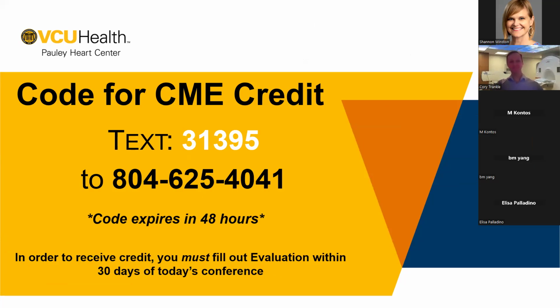I did want to make one comment about the heart rate or the time limit for obtaining images. 60 seconds is a very good guideline, but as we've all seen, or those who do stress echoes or any type of stress, it can be quite variable from patient to patient. Sometimes you have 90 seconds and sometimes you have 30. So we tell the sonographers, and it would be pertinent to any type of imaging like this, to get the images as fast as you can, because you do have the potential for missing ischemia.